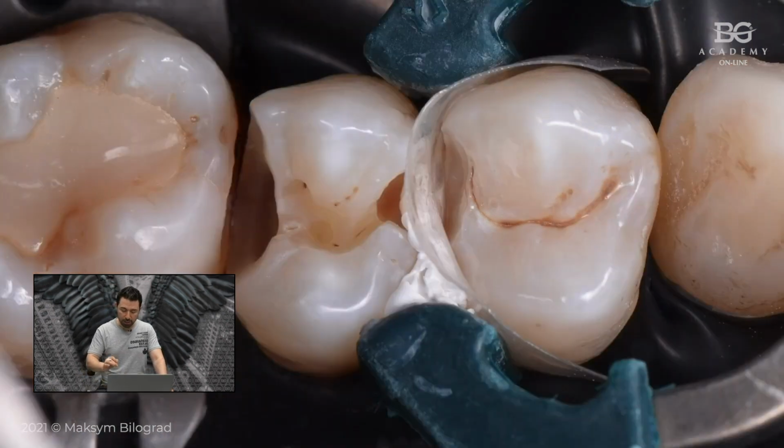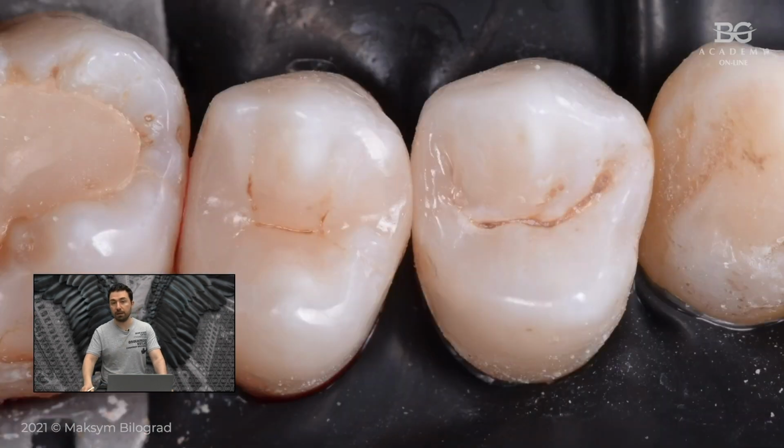So we continued with a direct composite restoration, done. And then we just prepped from the vestibular aspect and made a so-called window preparation for these premolars. So we combined direct and indirect restoration on one tooth, on both of these teeth.